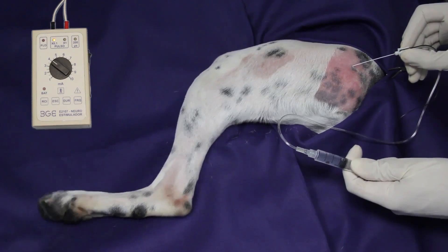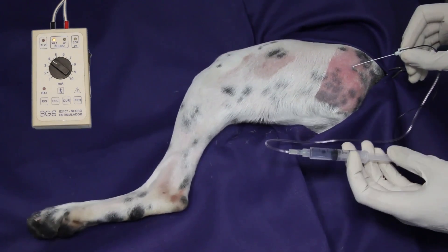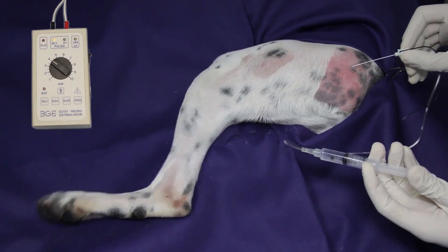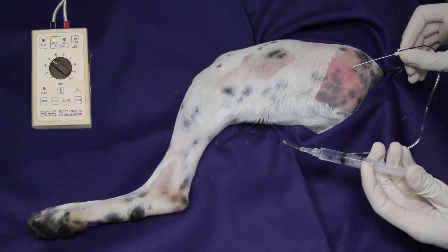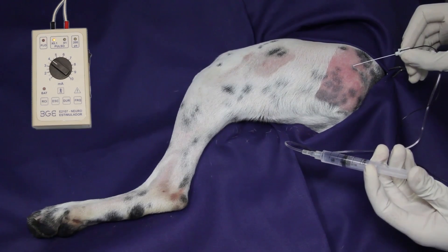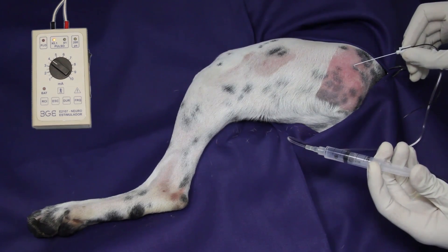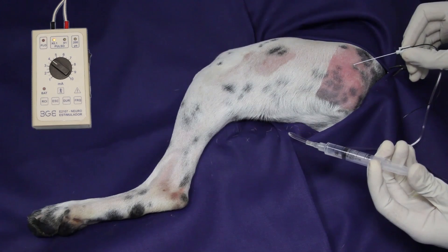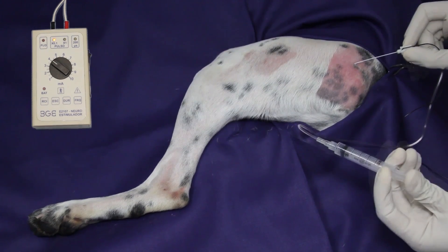Aspirate for the presence of blood and then inject a volume of 0.05 to 0.1 mL per kilo of local anesthetic. Note that the caudal gluteal artery and vein are located caudal to the sciatic nerve and its muscular branches.